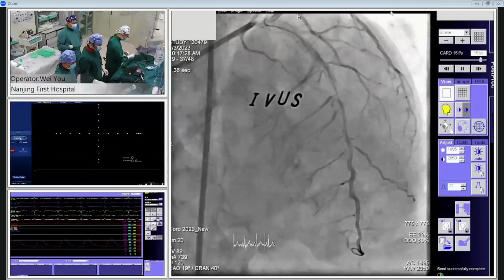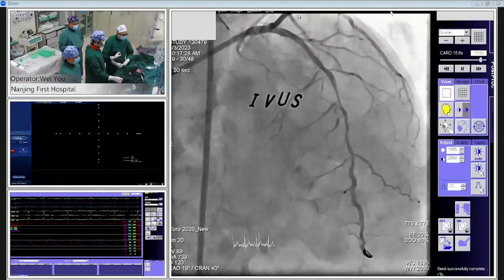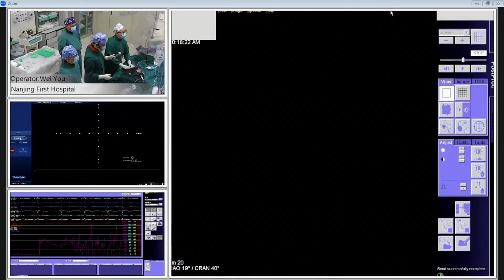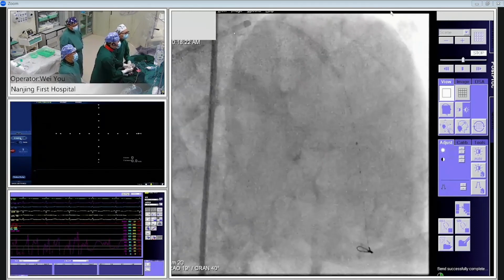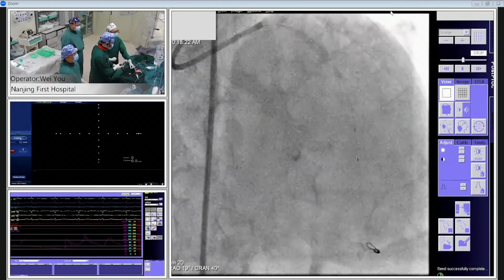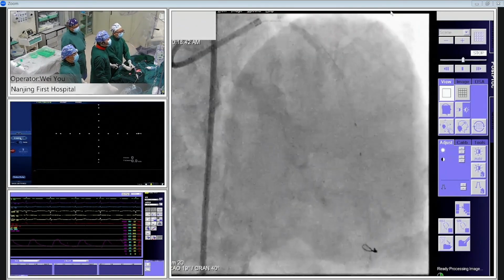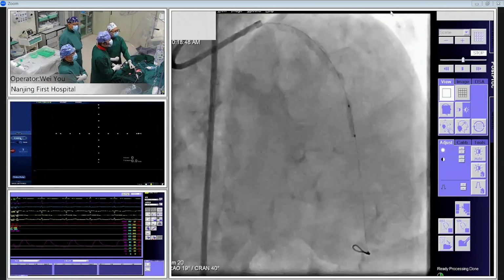So it's a typical stepwise IVUS-guided approach for severe calcification with rotablation and IVL treatment. After the ULTIMATE trial, in our intervention field worldwide, intracoronary imaging, especially IVUS guidance for complex PCI, has a very high penetration rate. In our cath lab, IVUS-guided complex PCI is nearly 100%, not only for trials but also for daily practice.